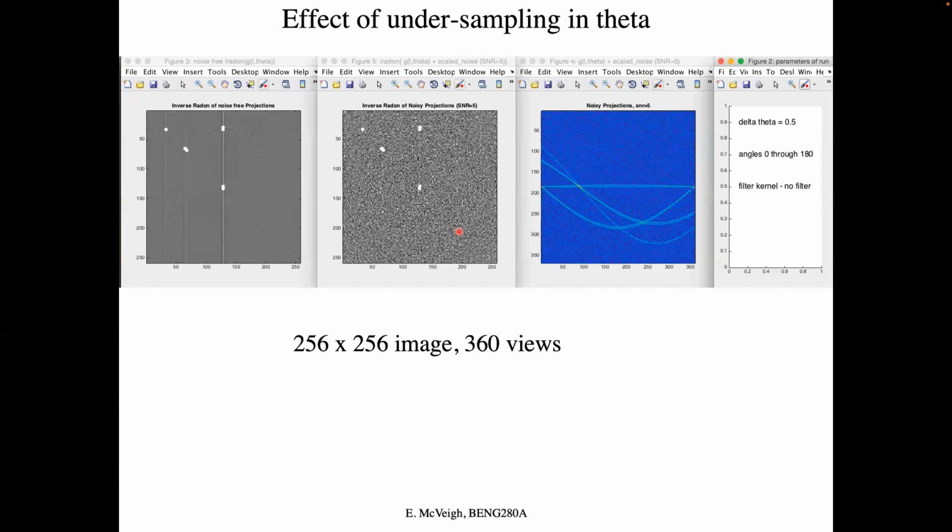Eventually, what's going to happen with each one of those views? If it now goes down to picoseconds and I have many views, thousands of views, what's the problem with each of those views? You got to ship all that data out, right? Which is one thing. So there's a limit on how fast you can ship data off the scanner. That's absolutely true. But there's something fundamental about the projections themselves, yeah?